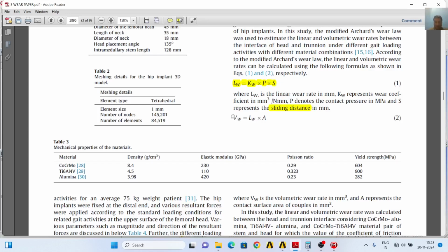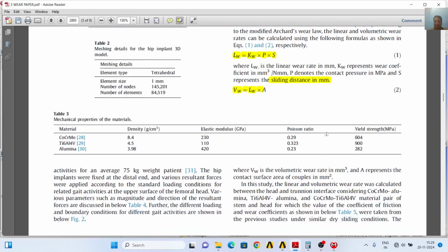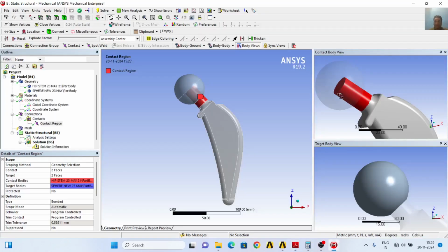If we want to know the volumetric wear, we need to know the linear wear LW and A as well. What is A? This is the contact area between these two bodies, which are the head and the stem. In the red color, you can see the contact area of the neck.